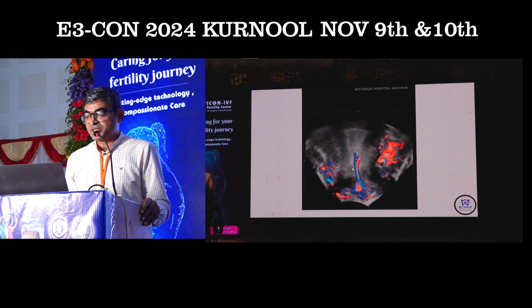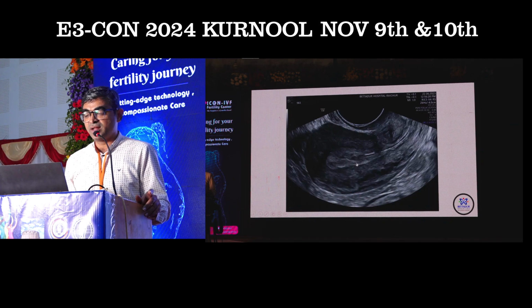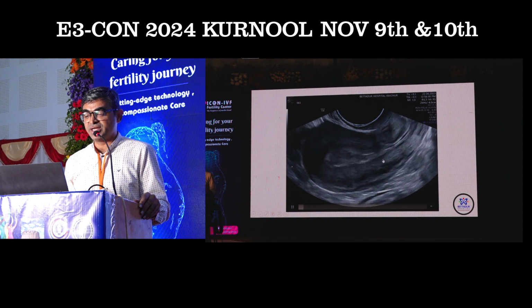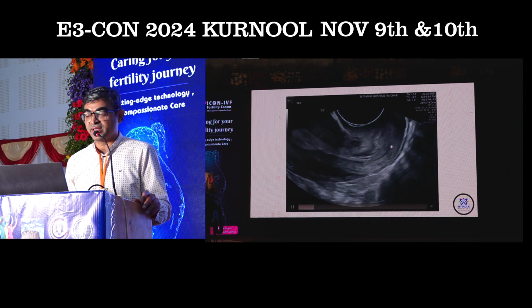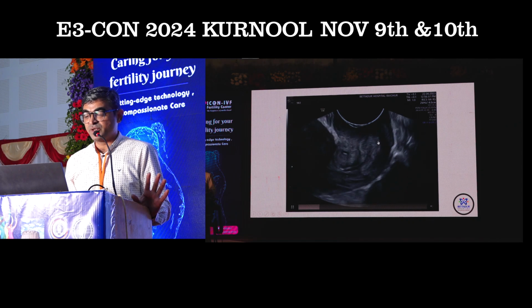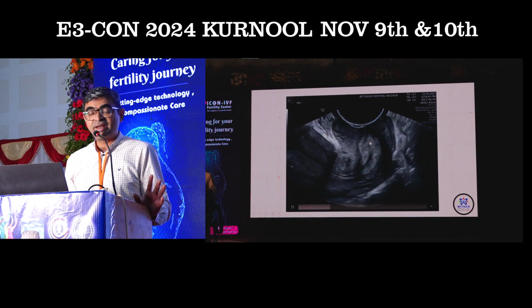Sometimes you are not able to see anything in the external cervical canal, but when I look into the cervix, you are able to appreciate a small echogenic thing standing out between the two cervical lips, and definitely you will ask me to put color. Yes, the color shows a single feeder vessel. Why am I trying to show this?